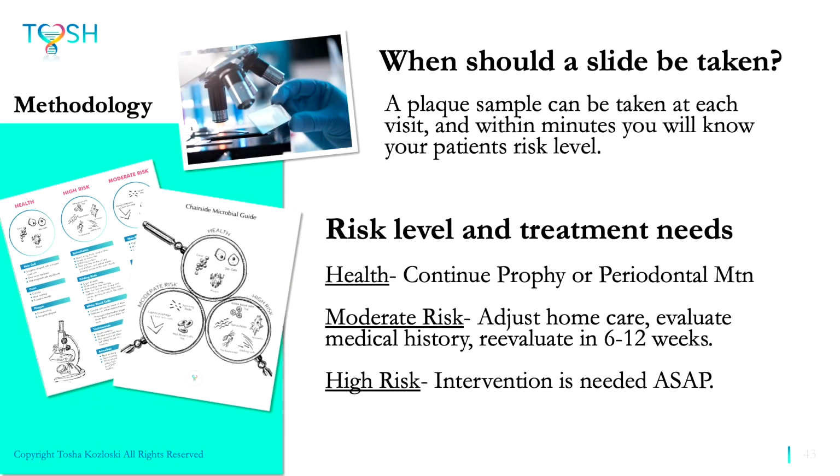So when should we take a slide? Barbara, when should we take a slide? We can take one every appointment, absolutely every appointment. So if you've never taken a slide before, we don't start taking a slide on every patient, but we start with a couple patients at a time. New patients are great. A patient that you see with any type of inflammation, it's such a great teaching tool.